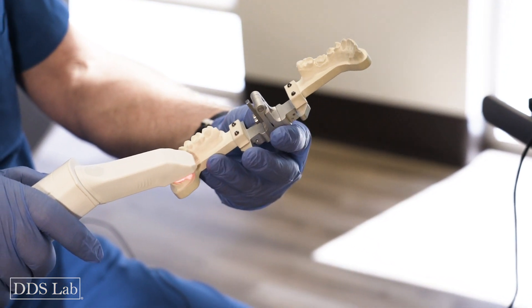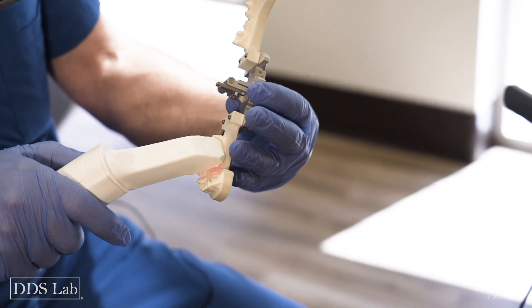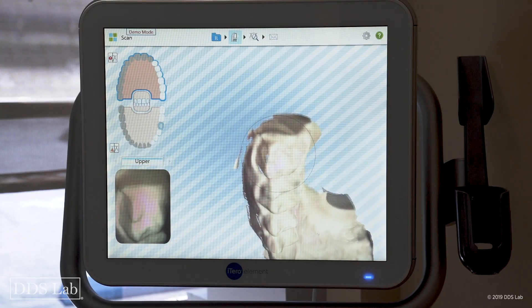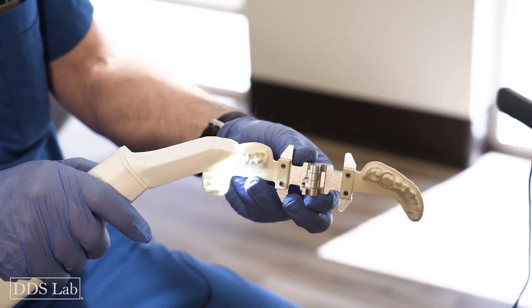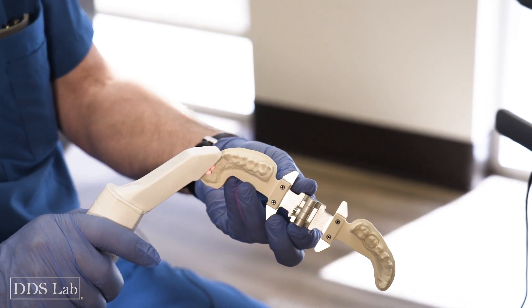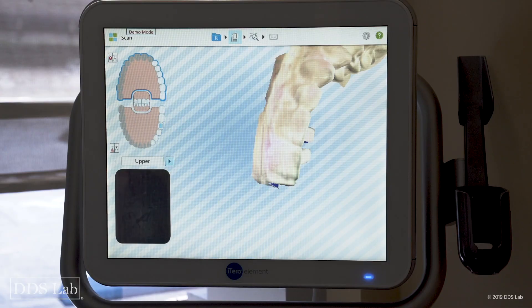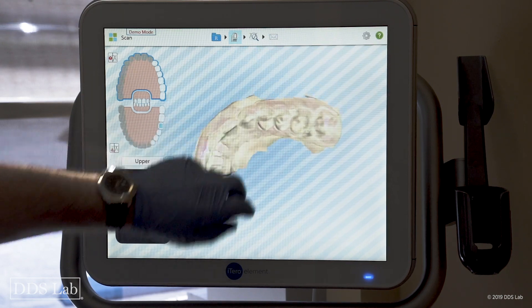I slant my camera a little bit forward, come back on the lingual part, roll over to the buccal making sure I capture everything, then come along to the facial part. I'm pretty much done with it — it took me about 45 seconds.